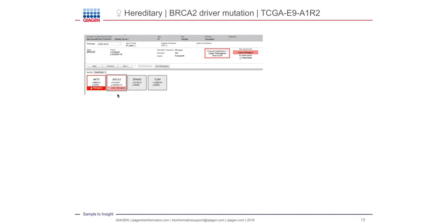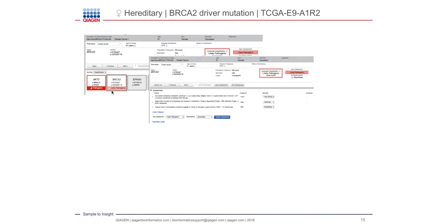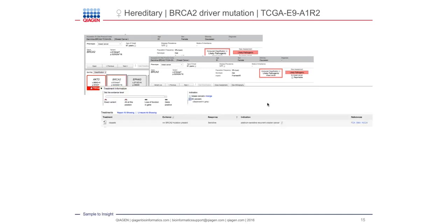But you can see how the rules can really differentiate subtle changes of information, where you see here variant of unknown significance, pathogenic, and likely pathogenic variant. When we dive into the assessment, we can see that the rules are a tiny bit different compared to the one before. We're still having an effect of a frame shift, a null variant in this case, absence from low frequency, absence from different controls, and there are multiple lines of computational evidence as well. But overall, all of that combined for this particular variant makes it a likely pathogenic case and not a pathogenic case.